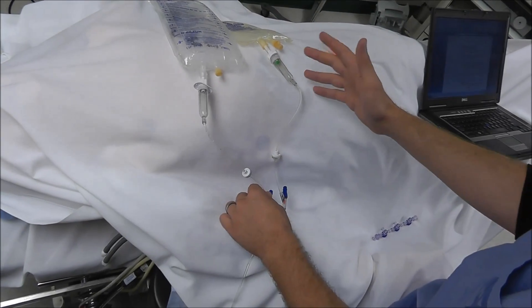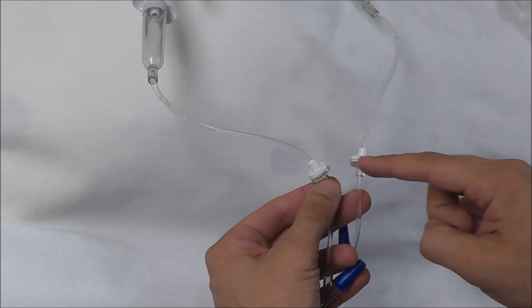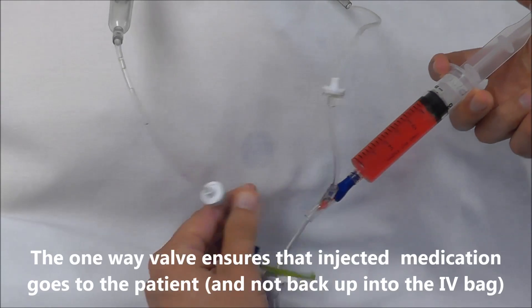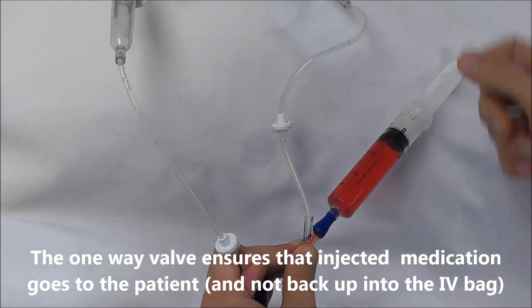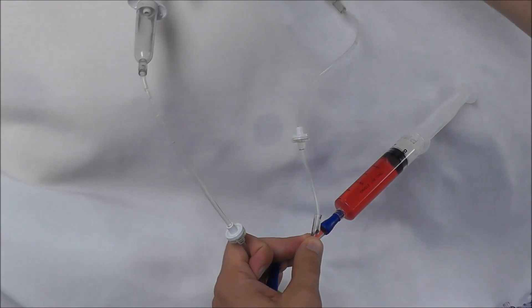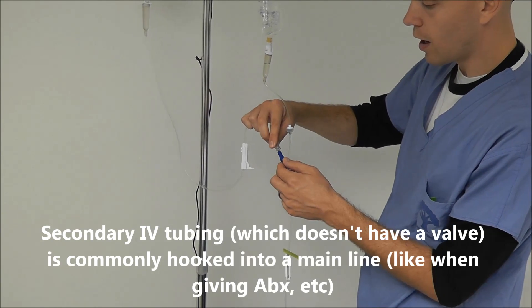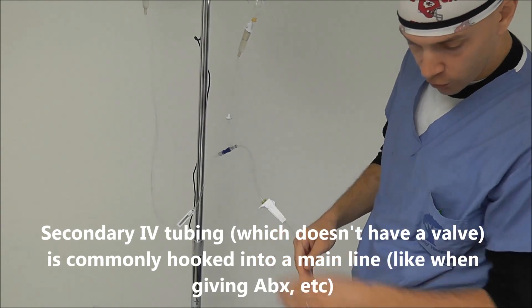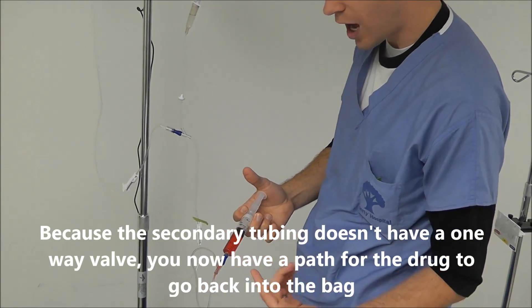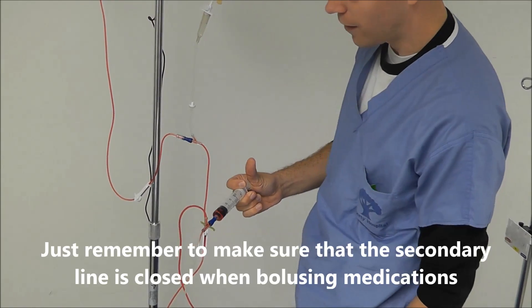Now let's look at what's on the primary and mini drip IV tubing. The first thing you'll notice is a one-way valve, whose purpose is to prevent anything I inject from going back up into the IV bag. However, with secondary IV tubing connecting into a regular luer lock port, if I inject a large amount of drug — which is common during anesthetic induction — fluid can actually go backwards all the way back up into the secondary IV line if that line is open.